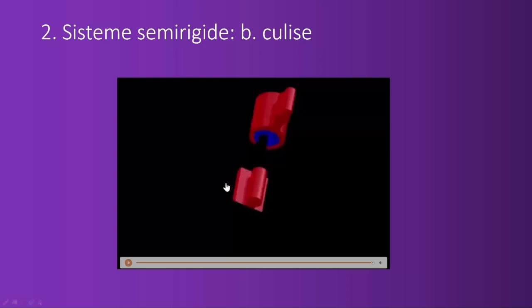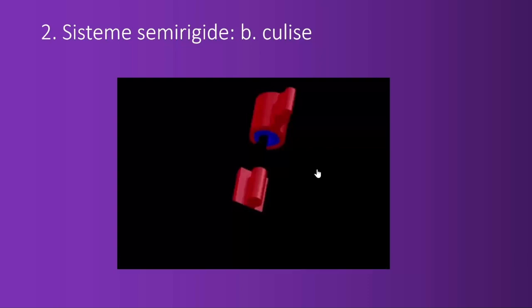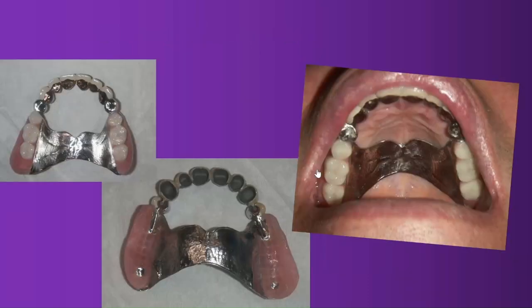Now, there are situations in which they only sell this matrix and the intermediate matrix, while the port matrix, I mean the outer structure that holds the frictional element in place, will be created by the technician, but those are details. So those are frictional devices, okay? It's not an equator, it's not a click, it's a frictional system. They are semi-rigid. What do I mean by semi-rigid?